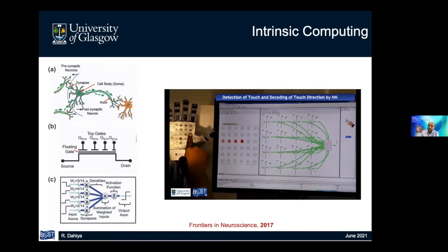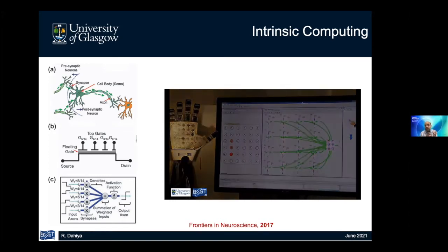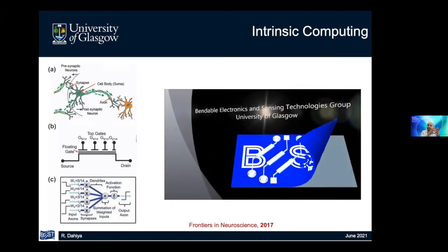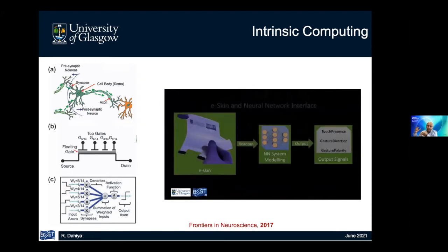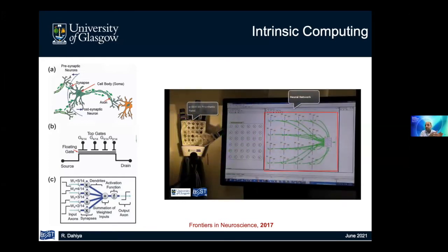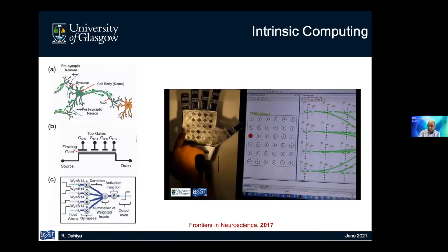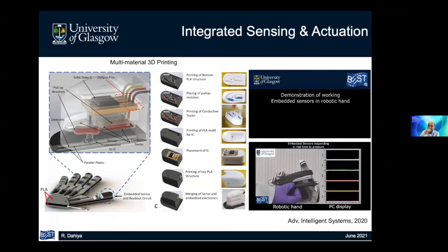Now, if you are able to scale down the information in this way, and the hardware can be implemented in hardware, the advantage is that this type of local computation leads to a lesser amount of data, and you are able to effectively use the limited communication bandwidth that you have in a robot or in a machine. It's in surgical instruments. You are able to send a large amount of data, or let's say optimally use the limited bandwidth. So this is the advantage here. Another example I mentioned earlier is in terms of making maintenance, etc.